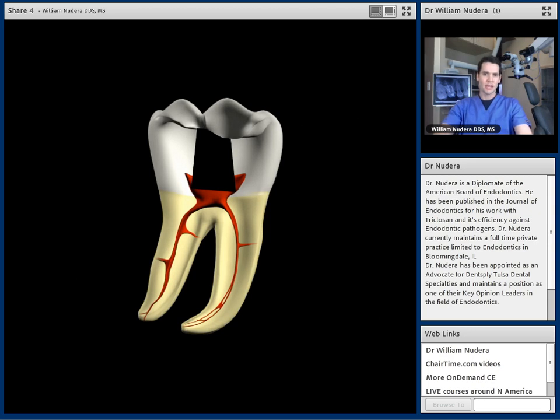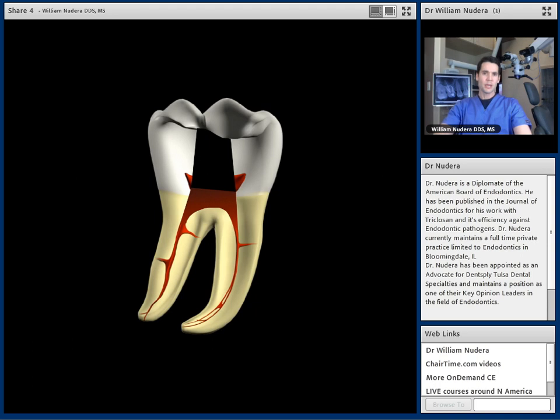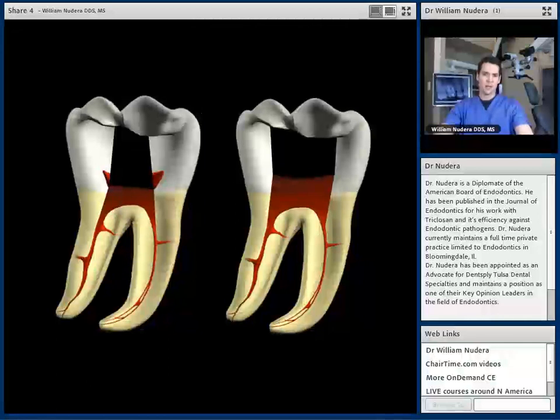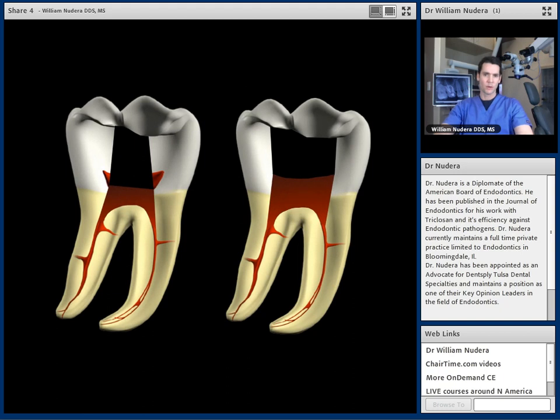For example, if we're working on a mandibular first molar in the mesial buccal canal, do we really need to visualize the distal lingual canal simultaneously? Probably not. When ready to treat that canal, we simply change the mirror angle to achieve the necessary straight-line access. When we look at the dentin at the level of the CEJ, we can see how much conservative dentin is maintained by keeping access preparations small. Placing these two access designs side by side, it becomes clear that the minimal access design achieves a more streamlined, restorative-driven endodontic result.